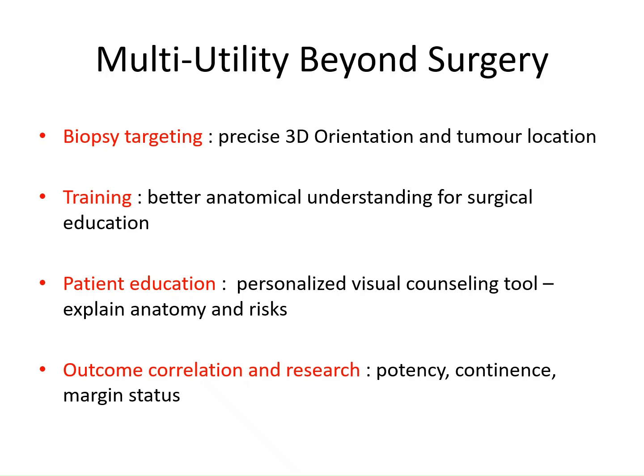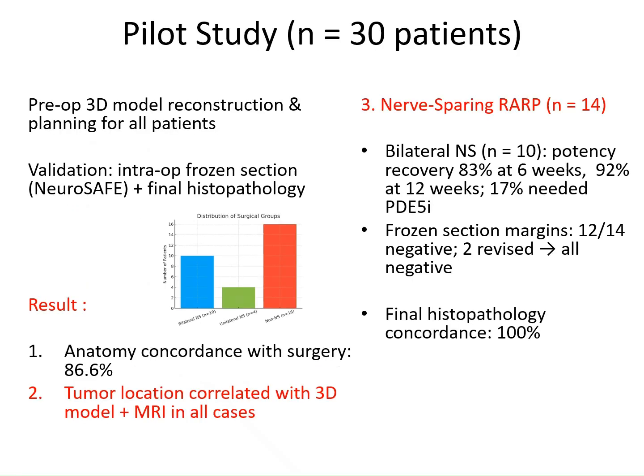These models have utility beyond surgery. They can guide targeted biopsy, provide residents, fellows, and students with a 3D understanding of prostate anatomy, and serve as a powerful tool for patient counseling, a personalized visual counseling tool for explaining anatomy and risks linked to any procedures. It also allows outcome correlation, linking anatomy and nerve preservation with recovery of continence and potency.